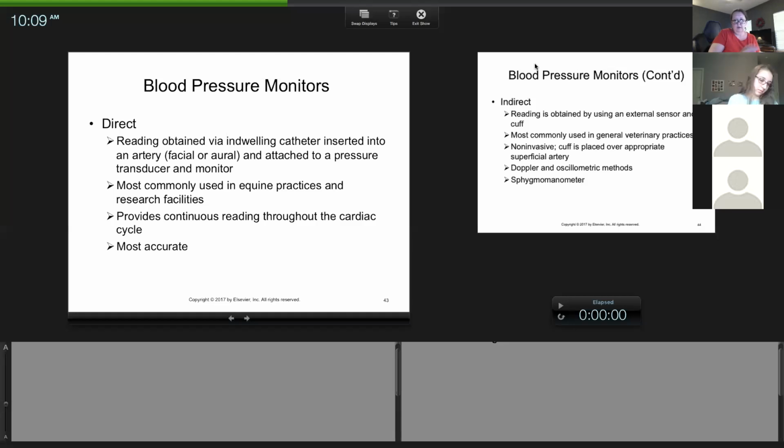We ended with blood pressure, and when I sent you the email on Friday, I sent 3 different videos. I sent the one where they were doing a Doppler. I sent one, when I say oscillometric monitoring, that is indirect because you're not in a catheter. You're on the limb, and when you puff up the cuff, that gives you an indirect measurement of blood pressure.